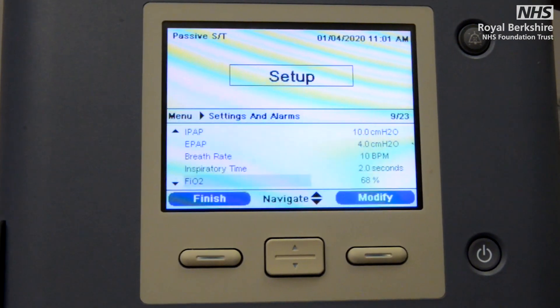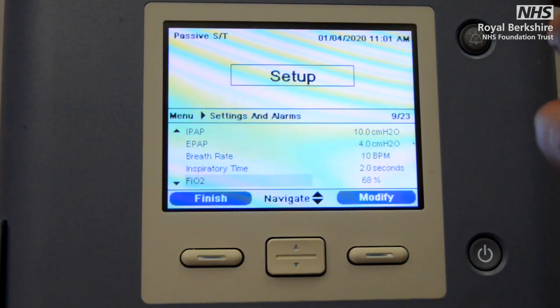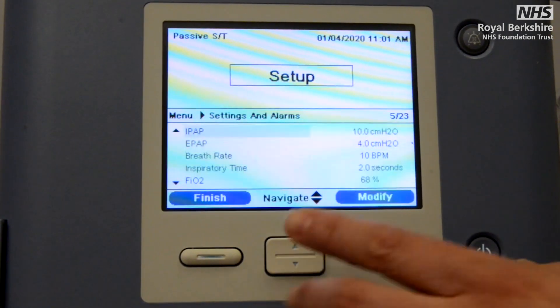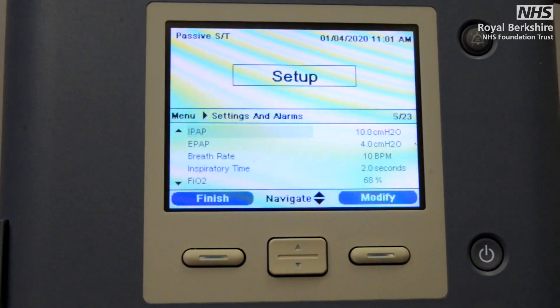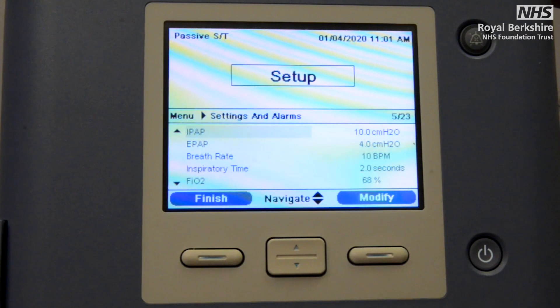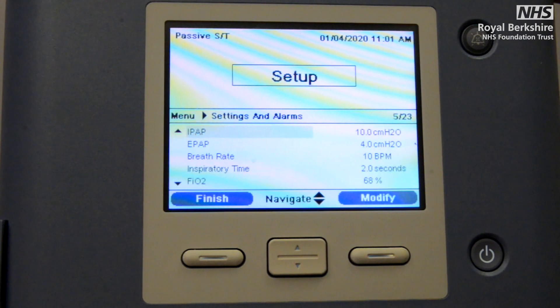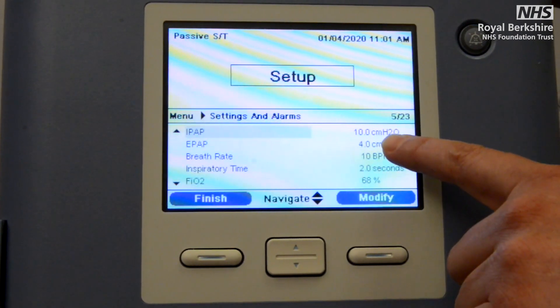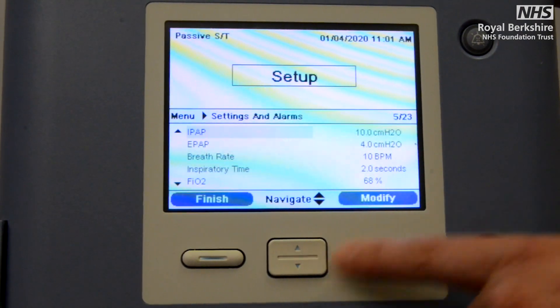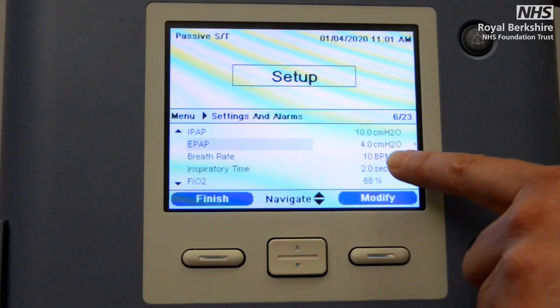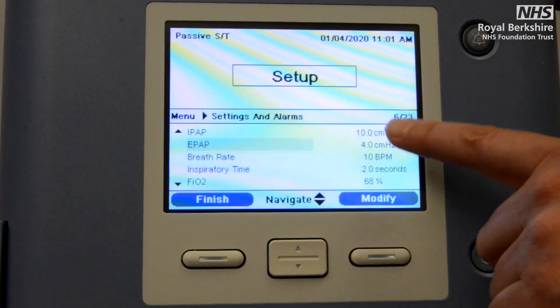We're augmenting the patient's tidal volume as well as augmenting their ability to perform gas diffusion in their alveoli. For IPAP, if this is for a non-COVID patient, we've referred to the rule box policy, and the starting pressure would be an IPAP setting of 10 centimeters of water. I'm happy with that — I do not need to modify this setting.